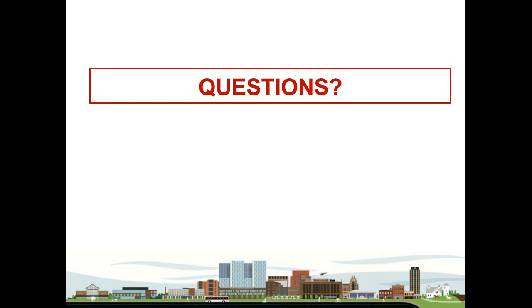Yeah, I'll try to answer this. I would direct anybody with a question like this to go to the IFU of the individual meter, because there you will find the recommended criteria for when and how to use a meter, whether it's temperature, humidity, and all this, and try to use the meter within those established criteria. These are the criteria for any meter that were actually submitted to the FDA. That's the range of temperatures, pressures, everything that you can use a meter for. So my advice is go to the IFU for that meter and see what is included in the package insert for the meter.